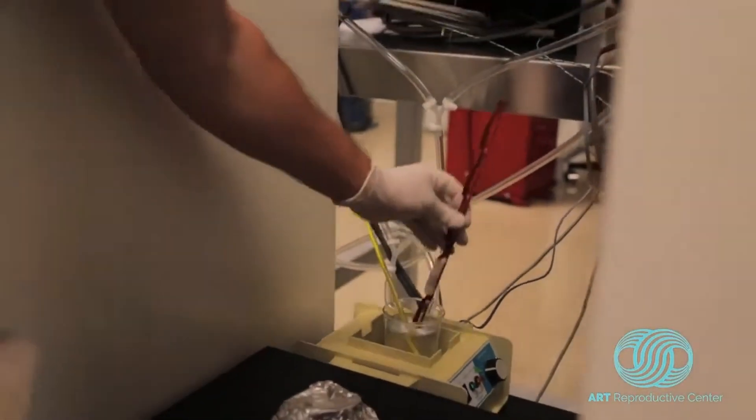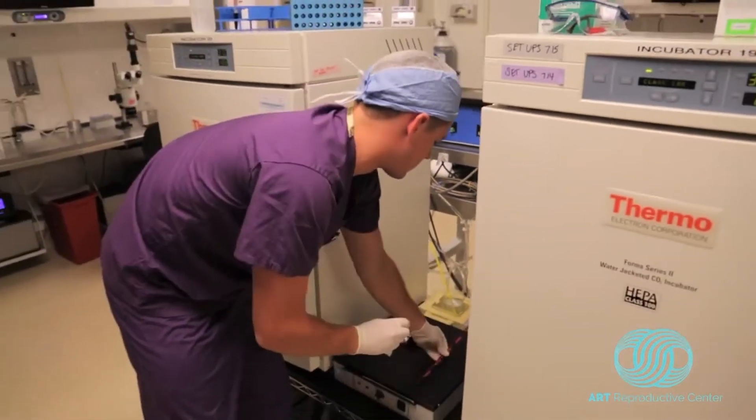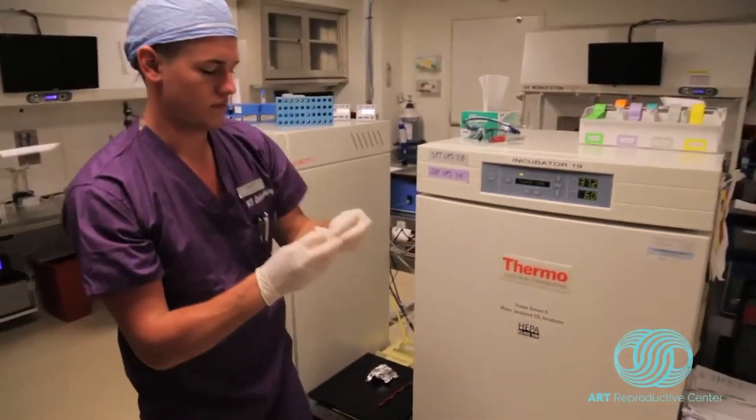Once that time point is concluded, the embryologist will remove it from the bath and bring it over to a sterile hood.